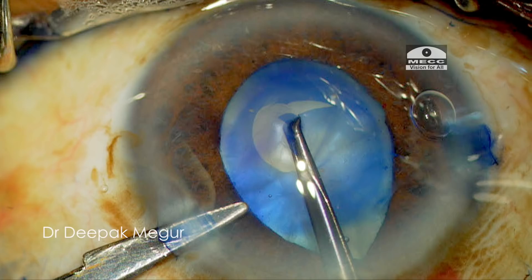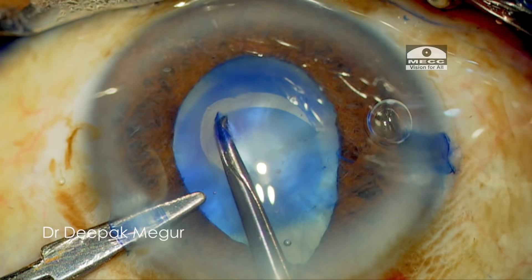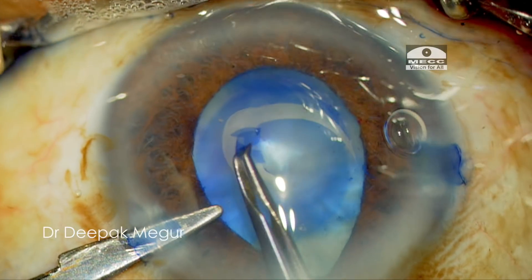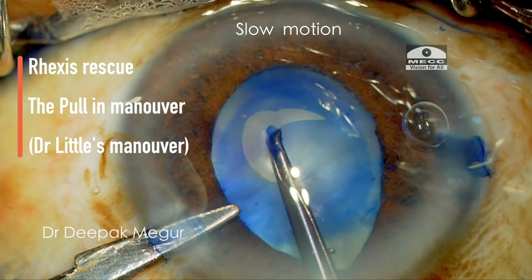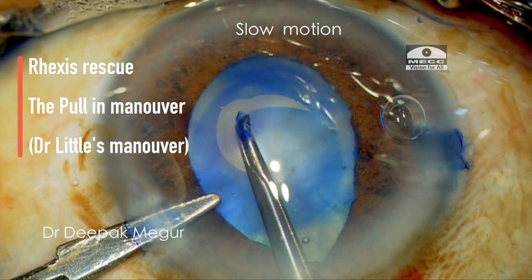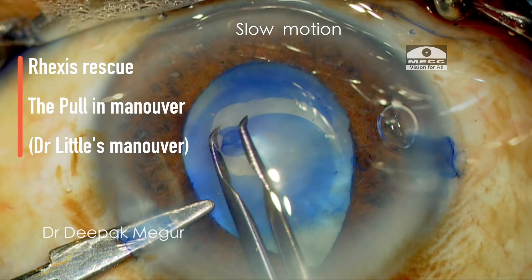At this moment I stop, I re-grasp and lay the capsule flat, unfold it, and change my direction of pulling. I'm pulling now towards the center of the eye in a centripetal manner. This is something like the pull-in maneuver or Dr. Brian Little's maneuver. I'm able to pull back the excess margin and prevent it from running radial.